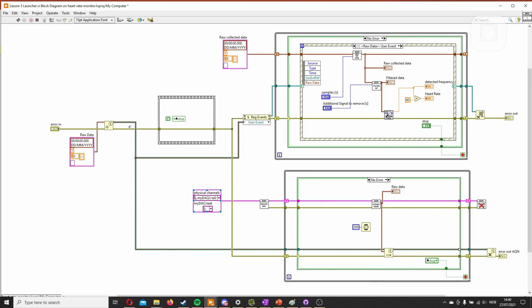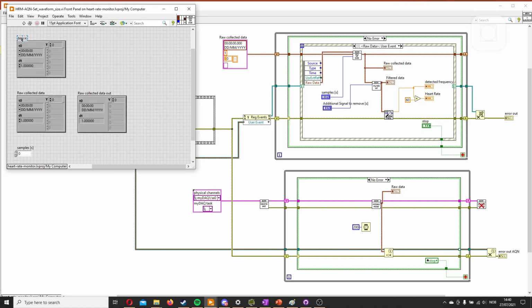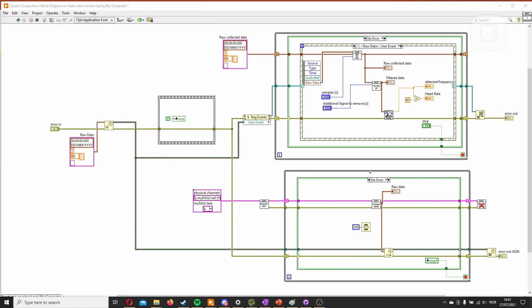Okay, so now we have the data going here, being sent here, and to receive it, we need the raw data output here, and we connect it here. You can also rename this to raw data in. And now this one can receive the data in parallel with this one without interfering. So if this one just freezes up or has a hold for any reason, this will just push the data in here, and there will be created a queue, and the data will just be read as fast as this one can read.